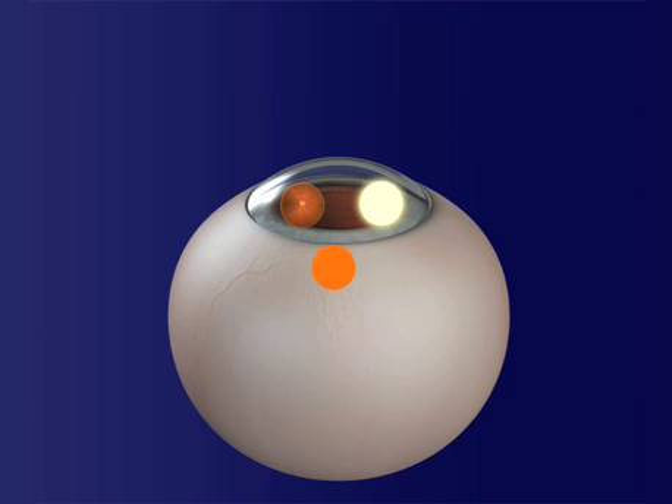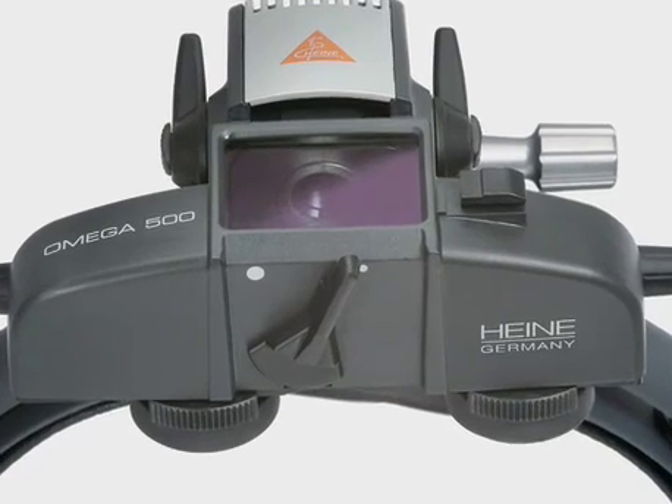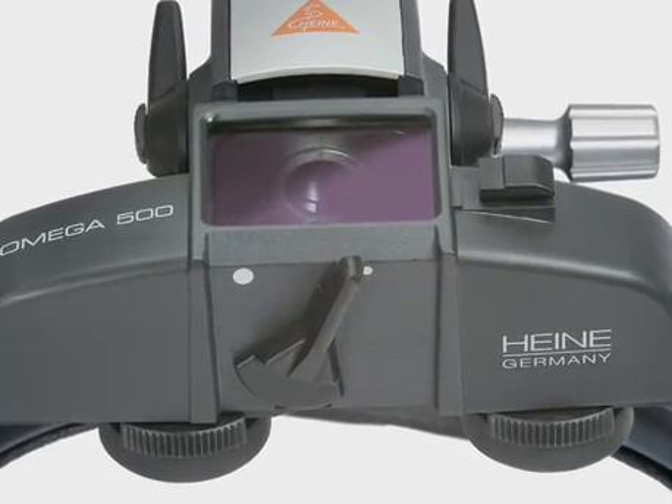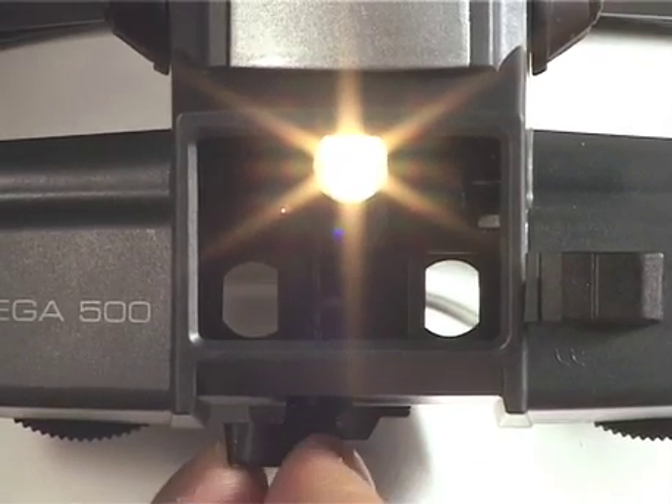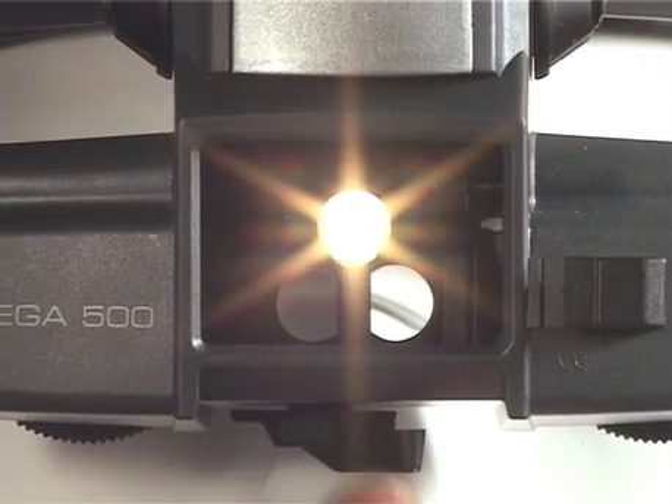However, the compromise is that there's usually a loss of stereopsis because now one or two of the observer beams fall outside the pupil aperture. Some newer indirects have variable pupil function, described earlier, that partially compensates for this pupil ovalization effect. This feature can be very helpful in this situation.